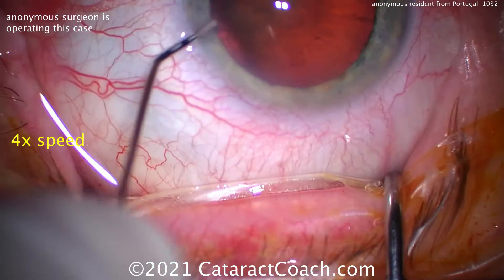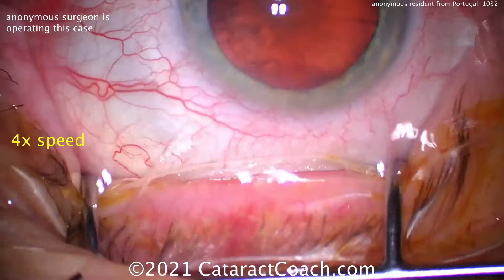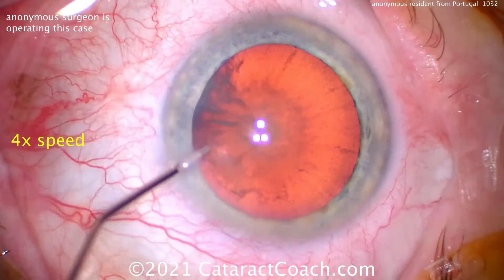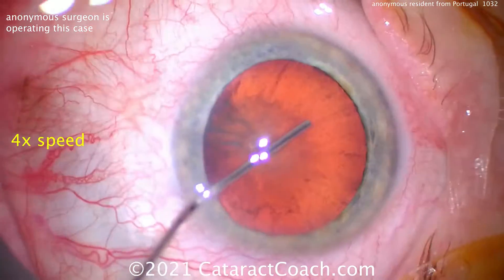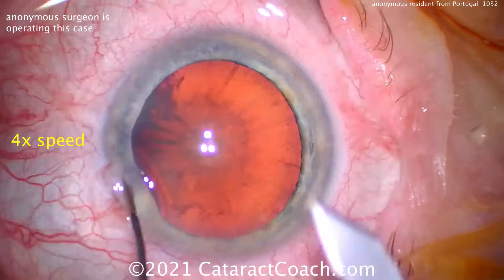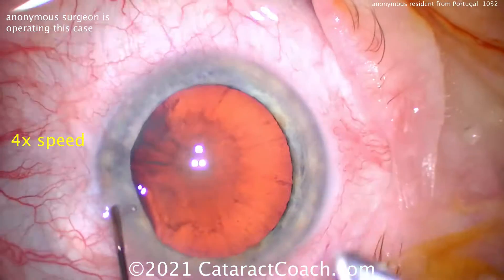We sped the video up to four times normal speed so that we can get through it in a timely manner. So there's the paracentesis — let's get that focus and the centration of the microscope — and filling the eye with viscoelastic. It seems a little bit fast because we have sped up the video to 4x.